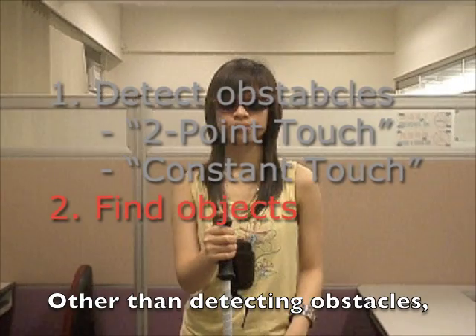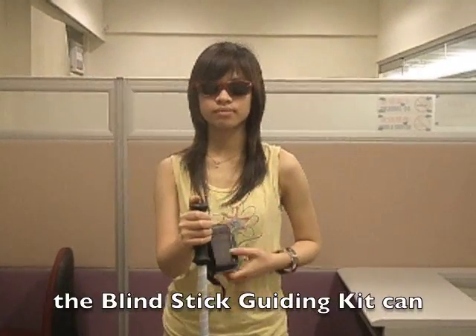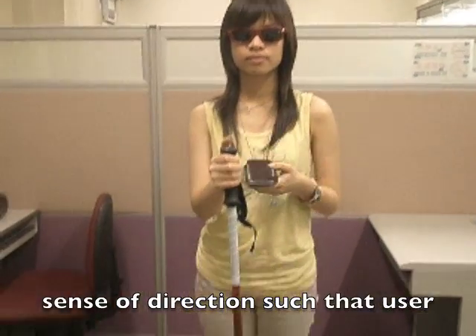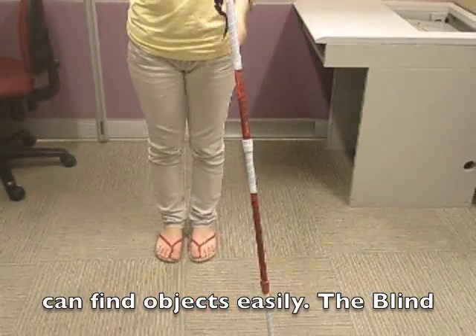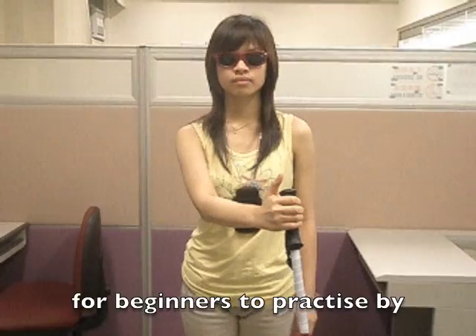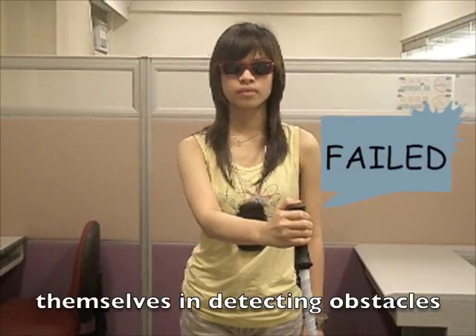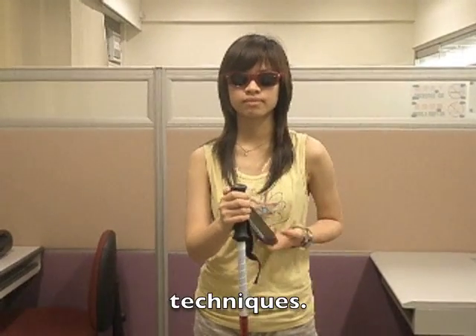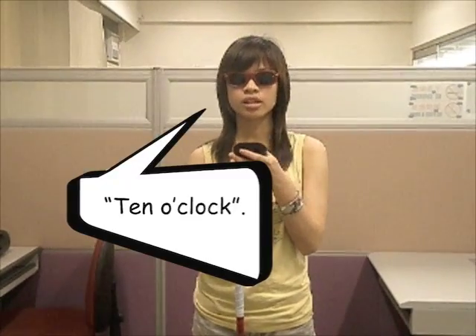Other than detecting obstacles, the Blind Stick Guiding Kit can help a user develop the sense of direction, so that the user can find objects easily. The Blind Stick Guiding Kit is a great tool for beginners to practice by themselves in detecting obstacles and finding objects with correct technique.